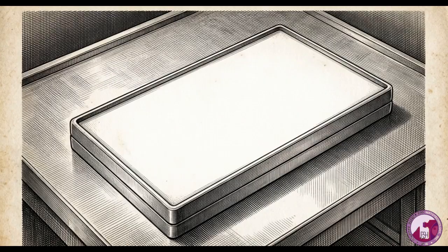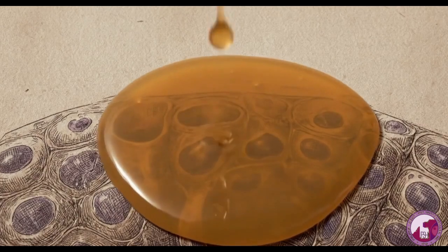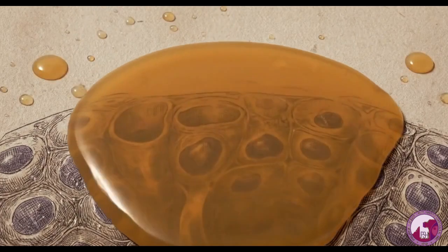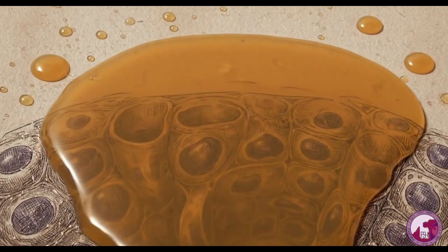Next is the total negative scenario, where both the patient tissue and the positive control show absolutely nothing. If even the counterstain fails to appear, the failure is entirely physical, not immunologic. The root cause of this total diagnostic void is incomplete deparaffinization. Residual wax acts as an impenetrable physical barrier, completely shielding the tissue from reagents.